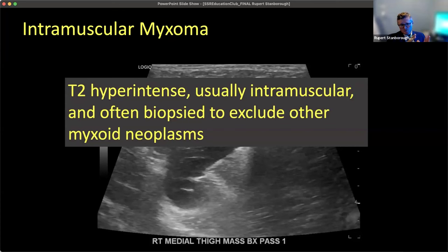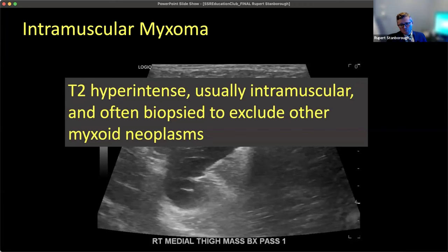To summarize: intramuscular myxomas are T2 hyperintense and usually intramuscular, though they don't have to be. We often biopsy them to exclude other neoplasms.